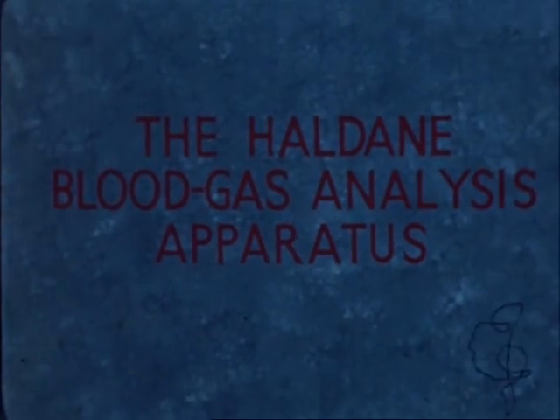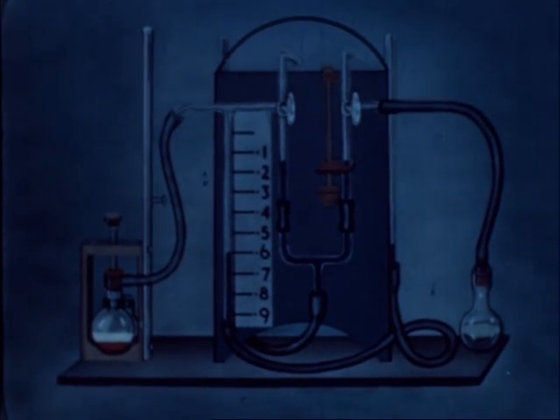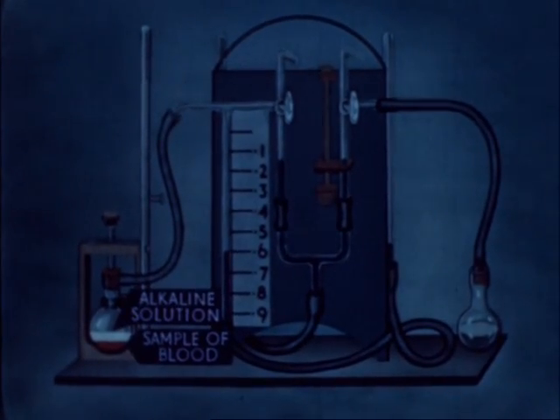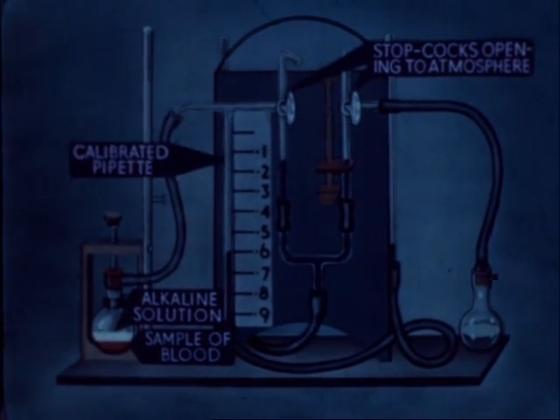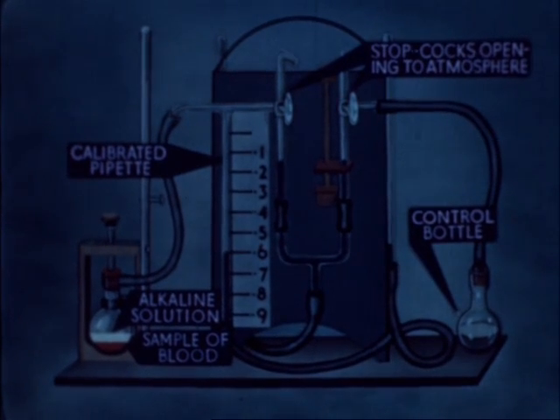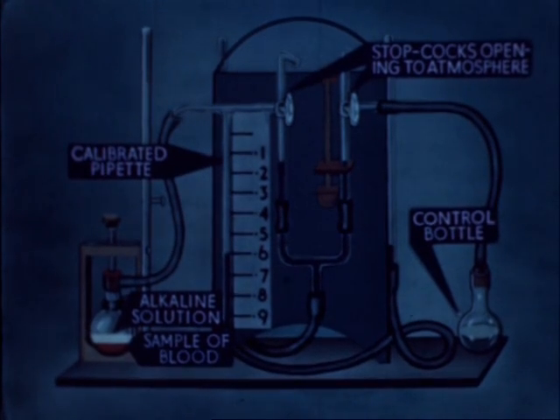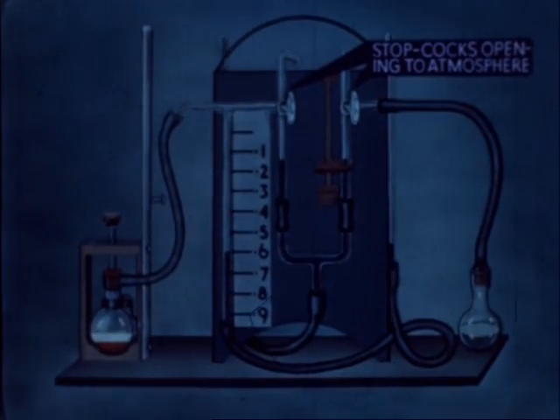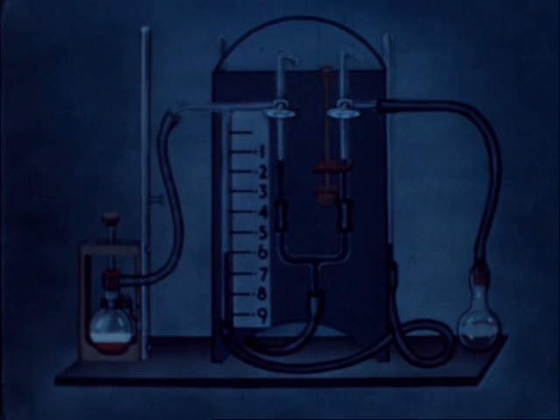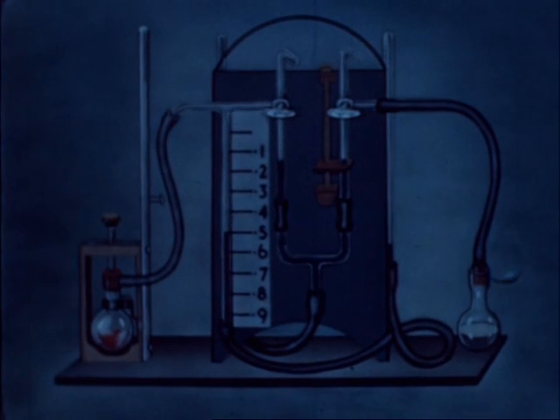These samples are analyzed in a Haldane blood gas apparatus. A measured sample of blood is placed in the bottle under an alkaline solution which will absorb any carbon dioxide. After various precautions, this blood is shaken and exposed to atmospheric air in the bottle. During this shaking, oxygen is absorbed, and the absorption of oxygen is shown by a rise of the fluid level in a calibrated pipette. The amount of oxygen which is absorbed by the sample is thus measured directly.